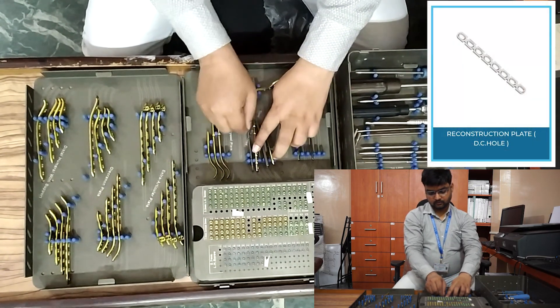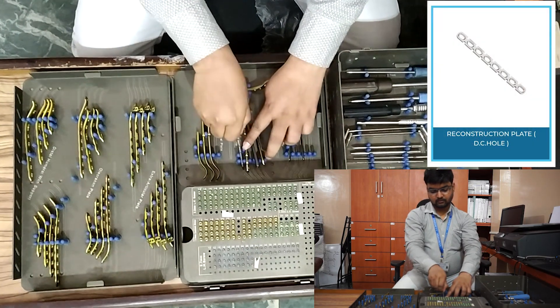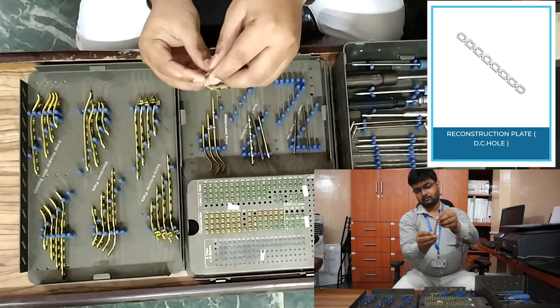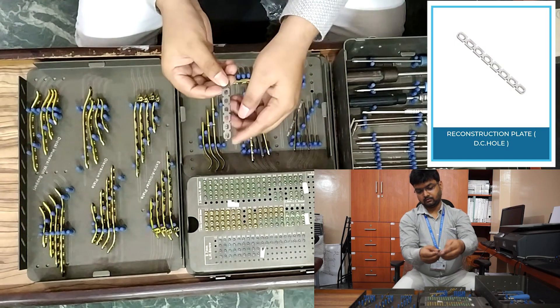Next, recon non-locking plate: five-hole, six-hole, seven-hole, eight-hole, nine-hole, and ten-hole.